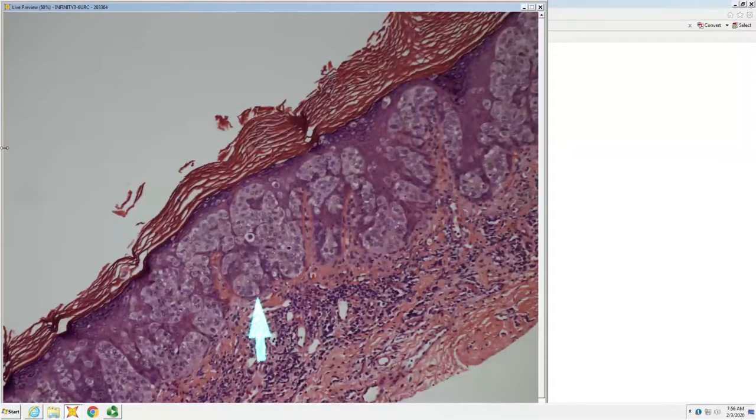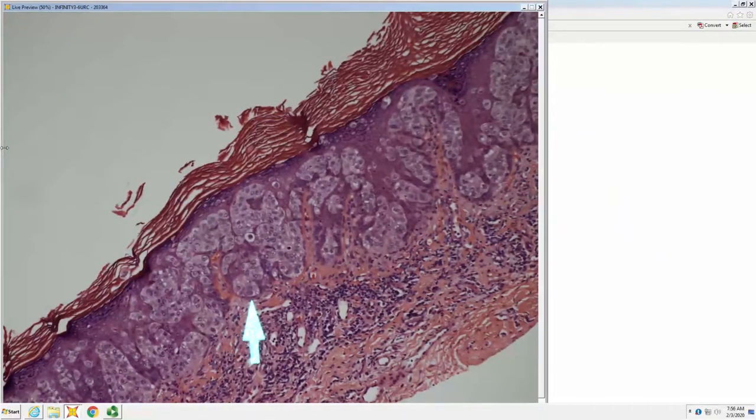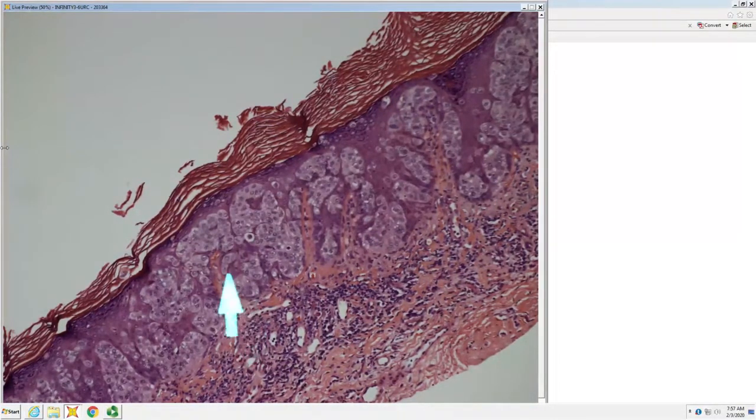What gives big amphophilic gray cells in buckshot scatter and nests within the epidermis, crushing the basal layer? Melanoma, but no. Not melanoma, because melanoma starts at the DE junction. So Sam's trying to tell you it is Paget's. So Paget's disease is one.